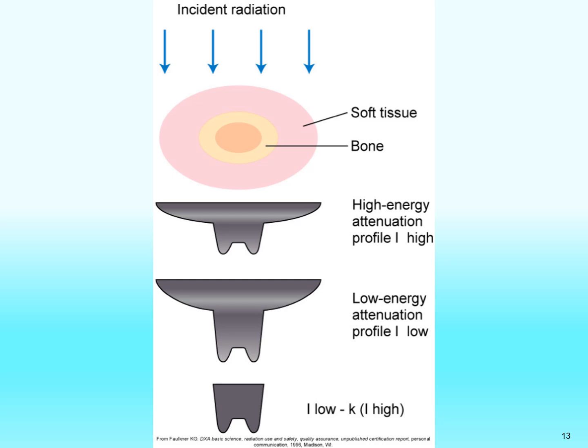And that's where we get the absolute value of the intensity of the low energy minus the intensity of the high energy, and then K is just some kind of fudge factor that the physicists have figured out to adjust for and estimate calcium score or calcium density or whatever.